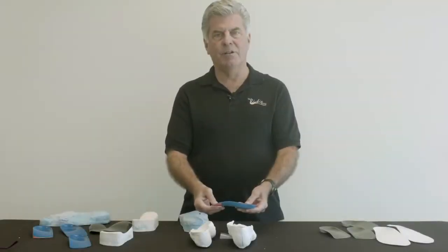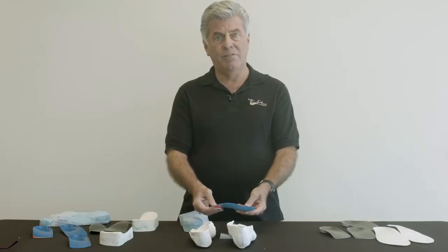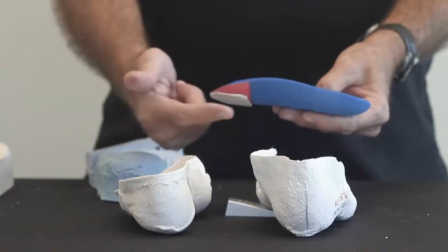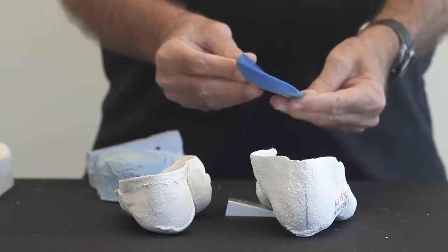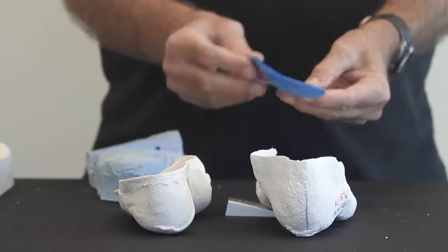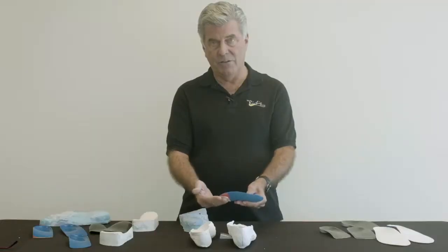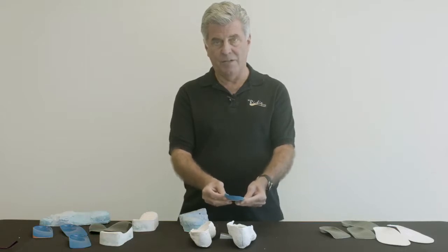Hi, I'm Dr. Doug Ritchie, and today we're going to talk about intrinsic posting of custom foot orthoses. Previously, we talked about adding a forefoot post to align the orthoses either into varus or valgus, and we talked about the advantages and disadvantages of placing a forefoot post on the orthotic shell itself.